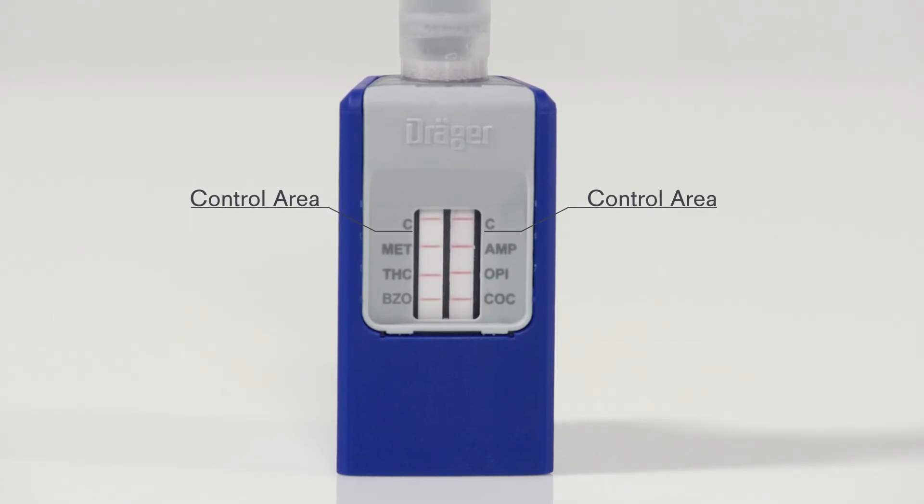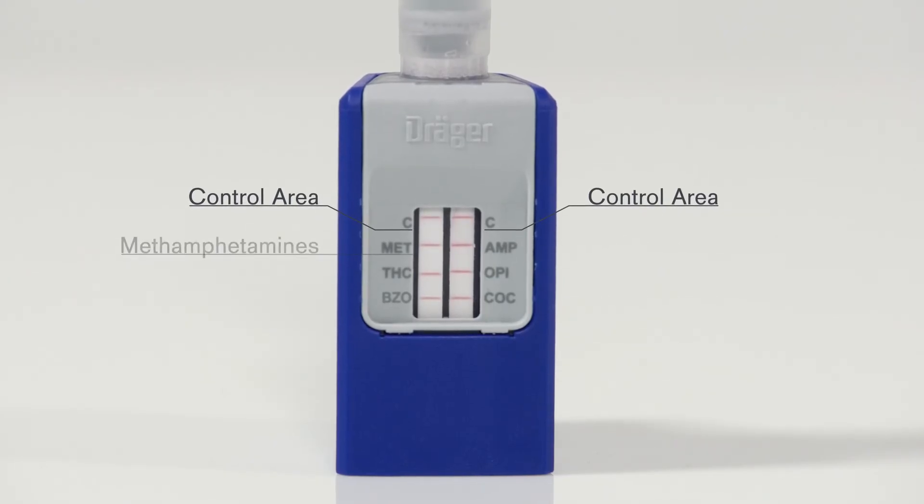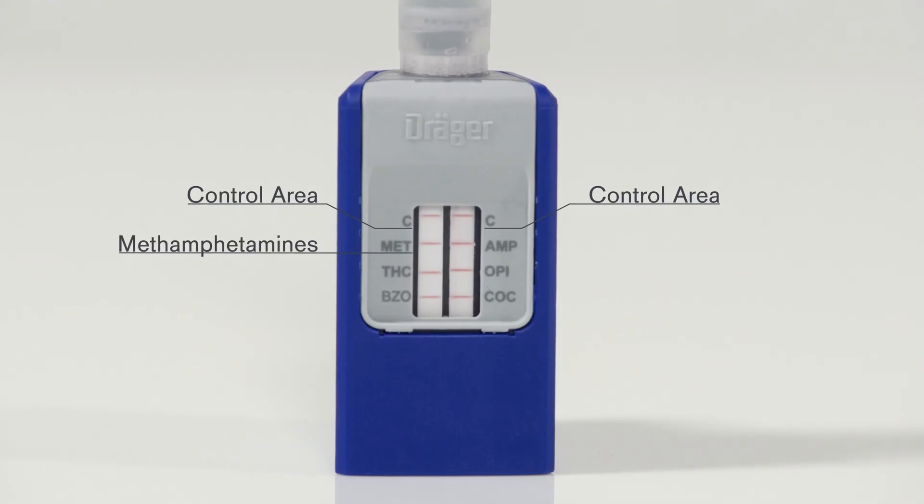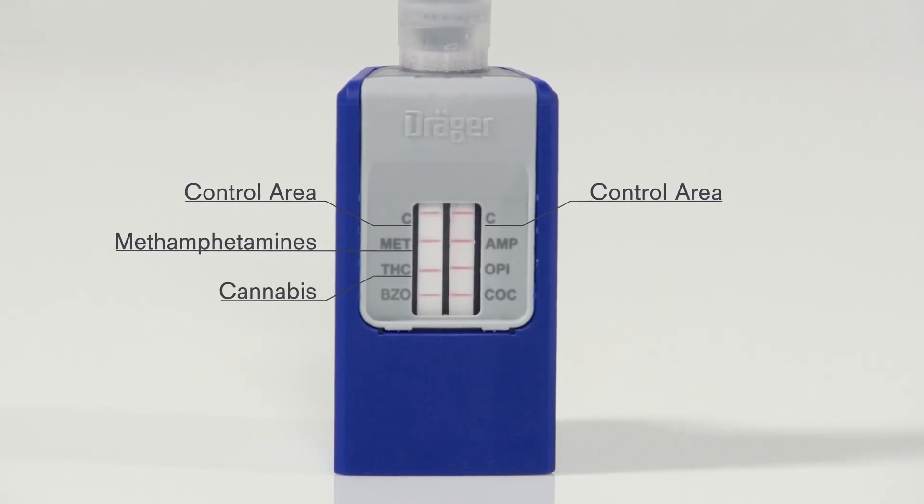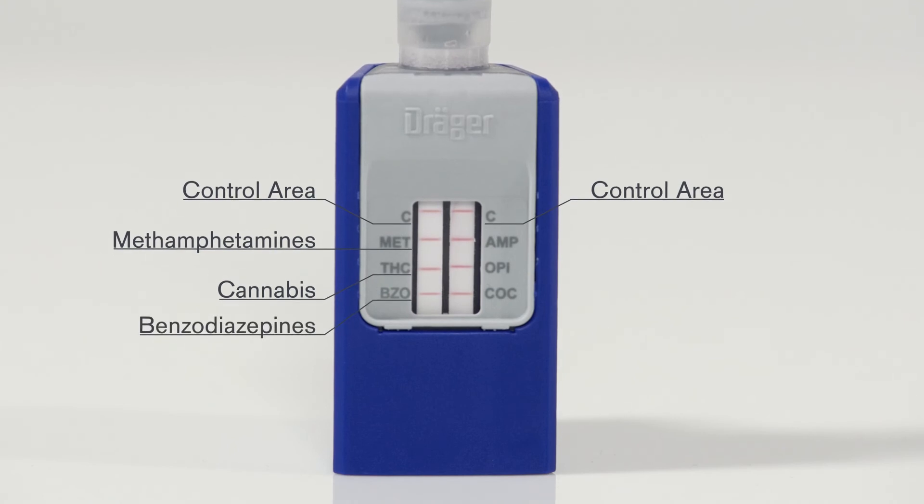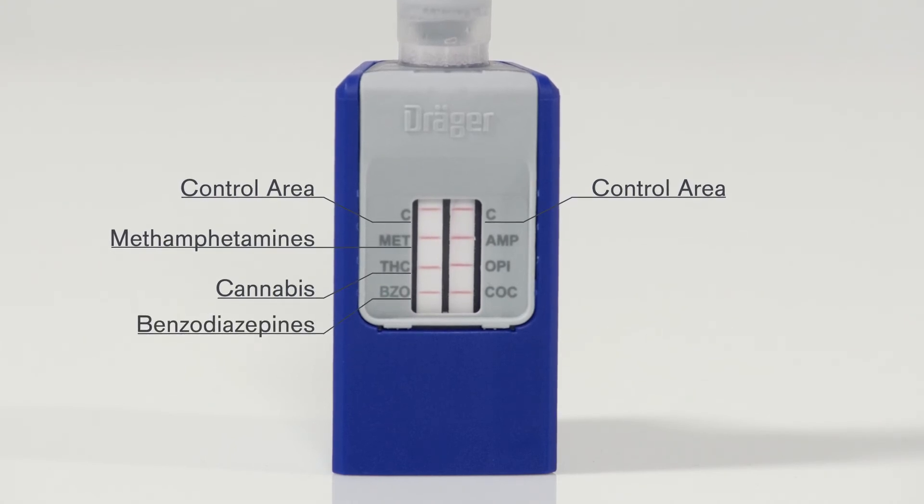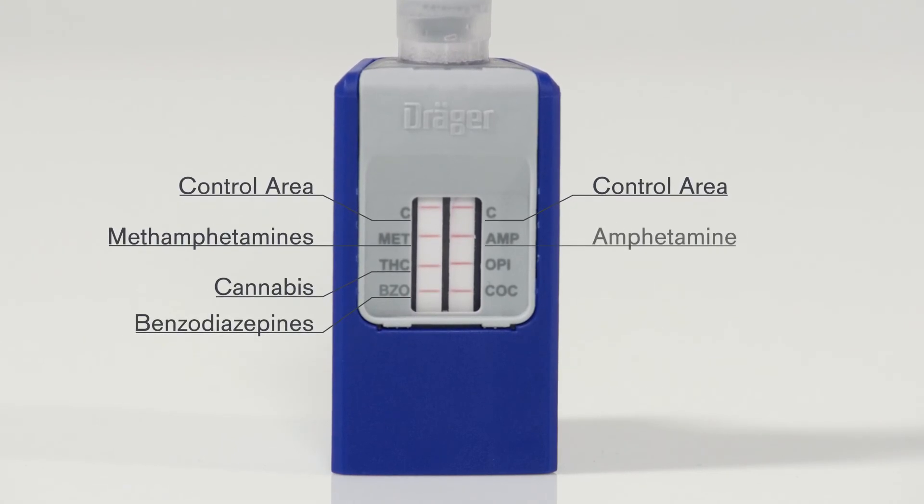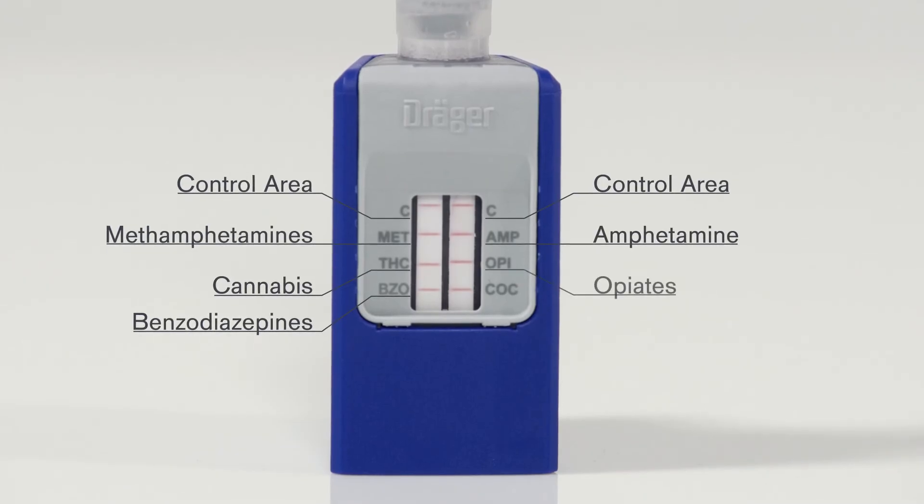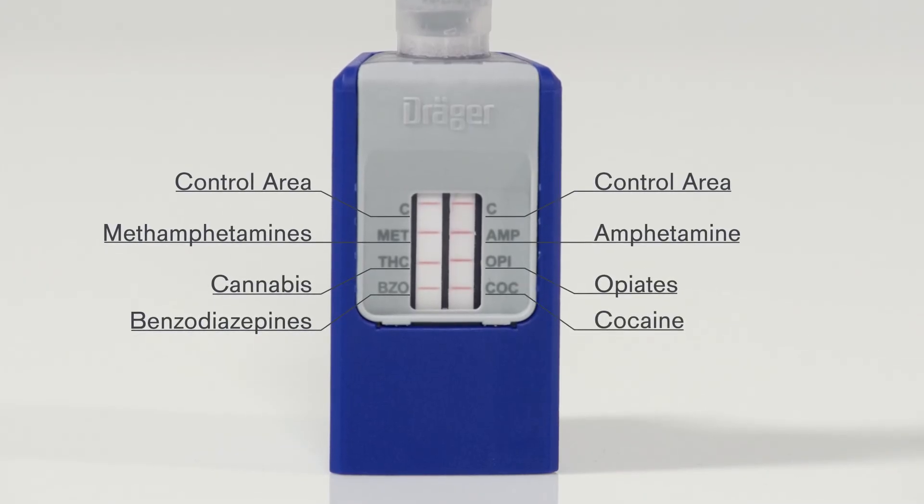On the left, MET stands for methamphetamines, THC for the active ingredient in cannabis, and BZO for benzodiazepines. On the right, AMP stands for amphetamine, OPI for opiates, and COC for cocaine.